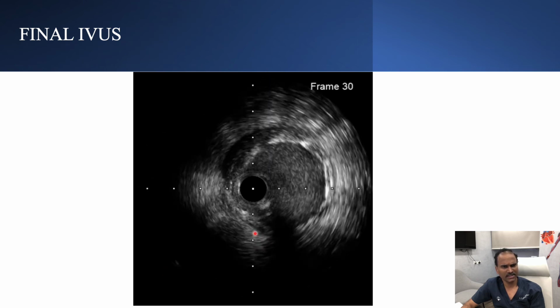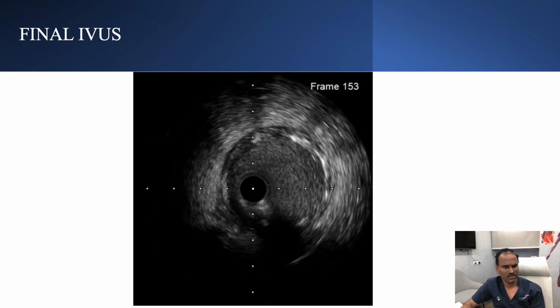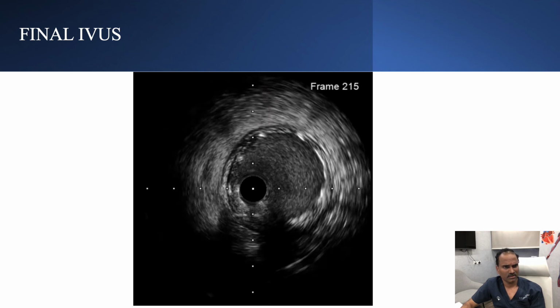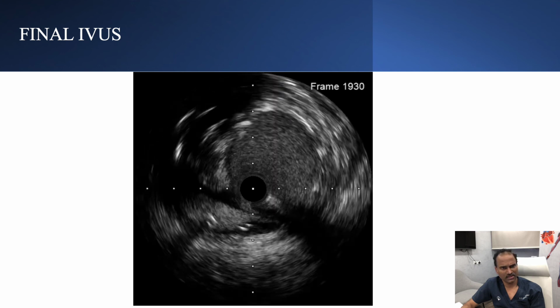And this is a final IVUS which clearly shows the aneurysm exclusion.